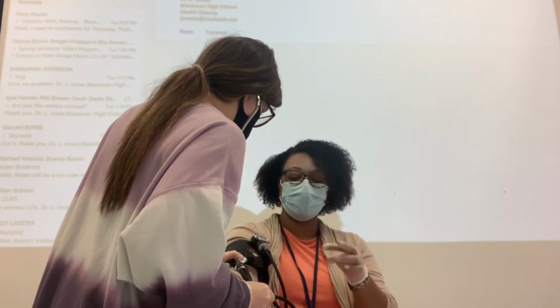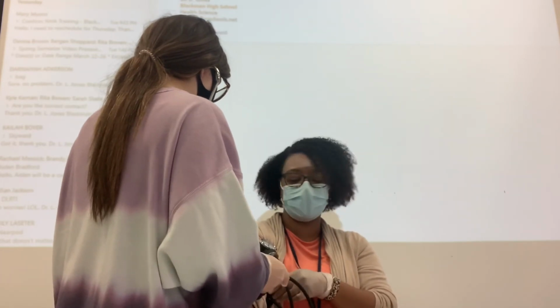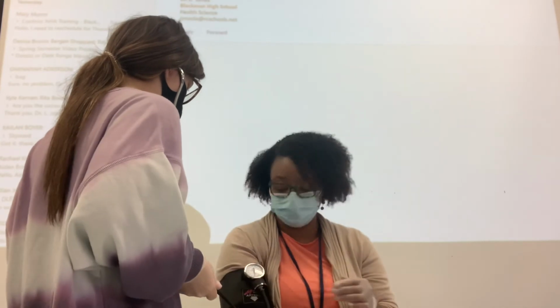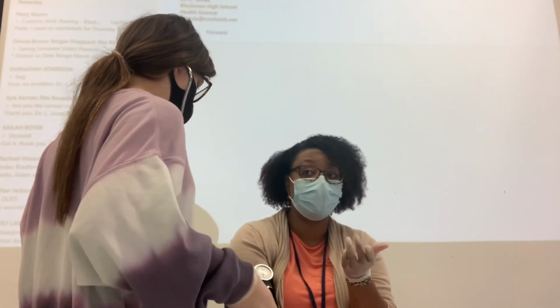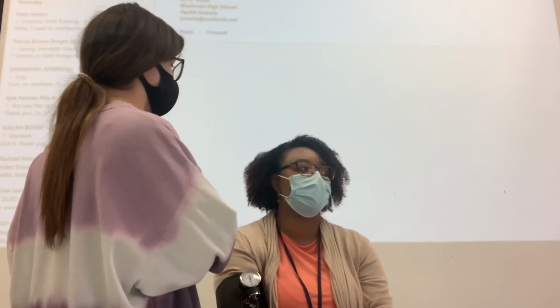And once you get that, then you open it all the way up so that your patient's arm can breathe, your blood can start going back down. Okay, so did you guys see that or hear me? Because I don't know if you can see, you were kind of over there. Yes. All right, so now what is the question you guys have?